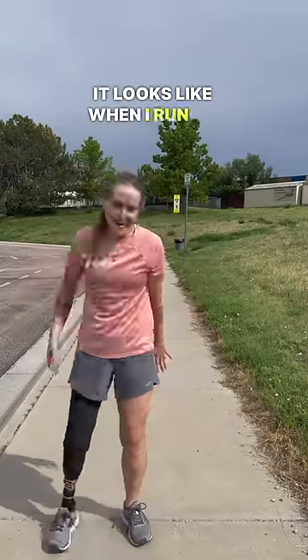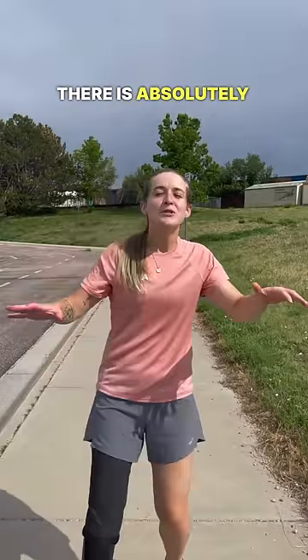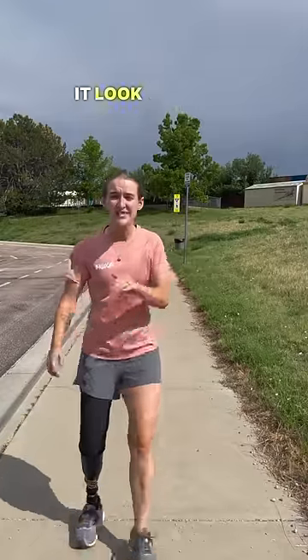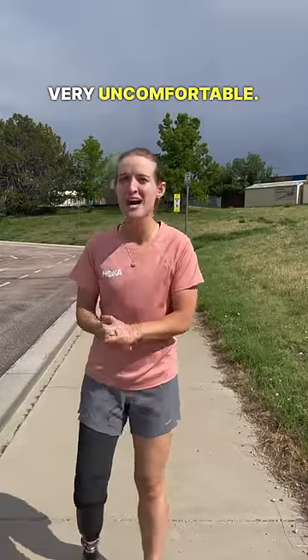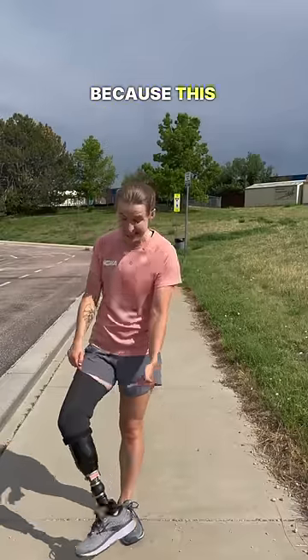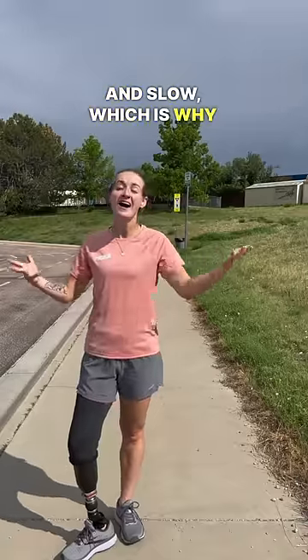So this is what it looks like when I run on my walking foot. As you can see, there is absolutely no actual bounce. There's no energy return coming from this leg. Not only does it look terrible, it's also very very uncomfortable. I feel so much pressure in my knee and my lower back and my hips because this is not built for that kind of motion. Inefficient, painful, and slow — which is why we use running blades.